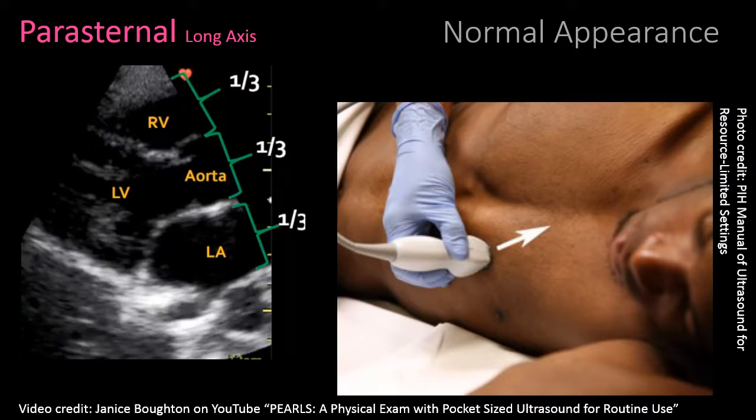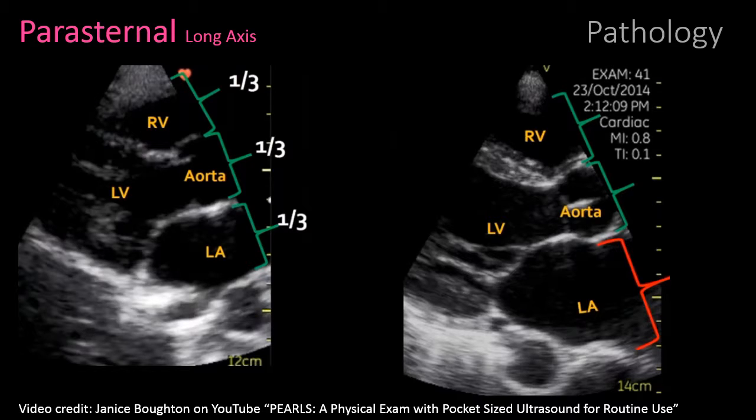This slide shows the rule of thumb that in a normal heart, the right ventricle, aortic root, and left atrium usually take up equal thirds of the base of the heart. In the next slide, we focus more on the base of the heart. Looking there, we can identify left atrial enlargement by visually comparing the left atrium to the aortic root. Usually these are about the same size, and an atrium that is larger than the aortic root is usually enlarged. This often indicates ventricular dysfunction, especially diastolic dysfunction, and is also present in valvular heart disease and congenital heart disease.